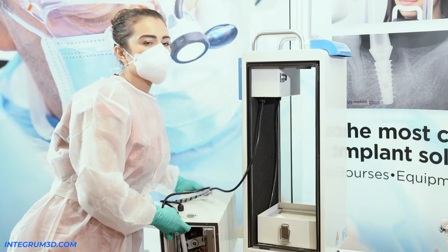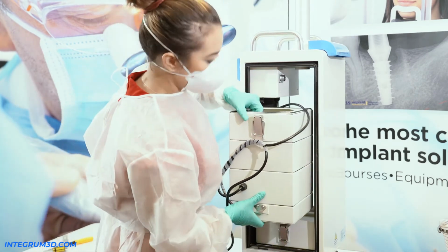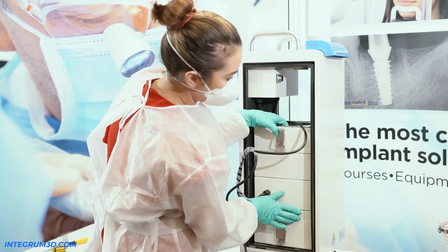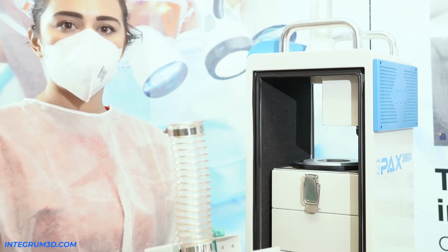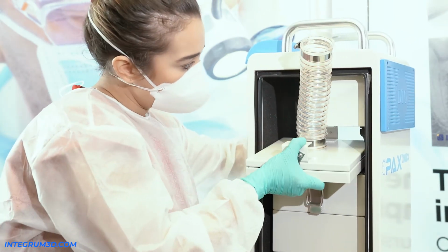All right, now that we have officially changed everything in the machine, we want to put it back the way it came. Make sure you put this piece back all the way until it clicks inside, just like that. Now you're going to put this piece back on, just the way you took it out.